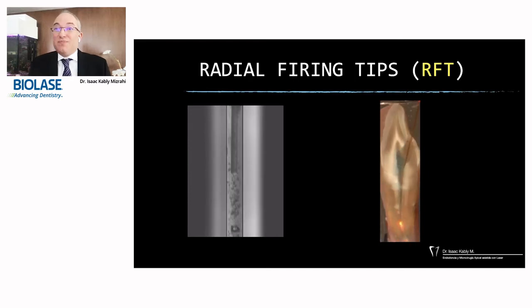And if we add the energy transmitted or scattered through the dentin into the bone and surrounding tissues, then we will get the main advantages of lasers and their interaction with the biological aspects of the root canal. We will get healing, we will get alkaline phosphatase induction, and we will get ATP production, and many healing processes getting started at this moment. So this is very important. We are creating a mechanical effect, that cavitation effect with these micro bubbles, but this is not the main thing. This is not what makes lasers special.